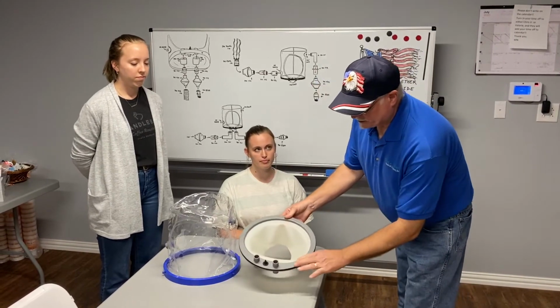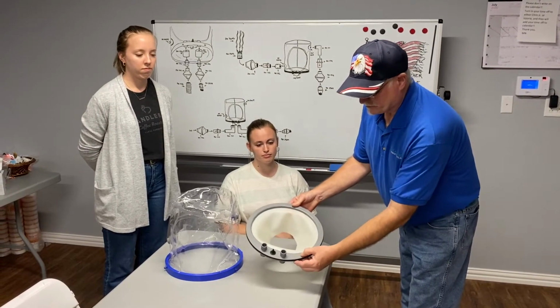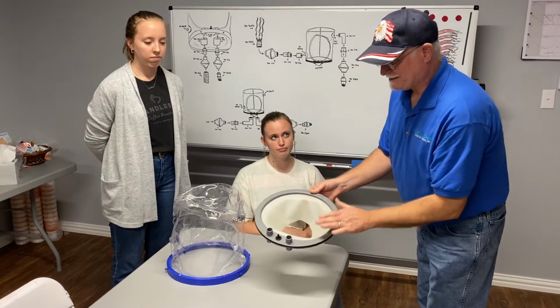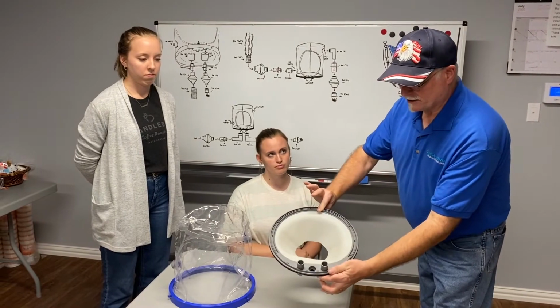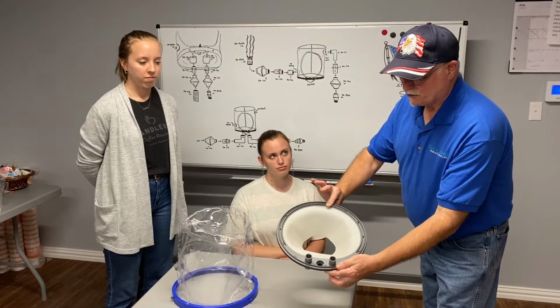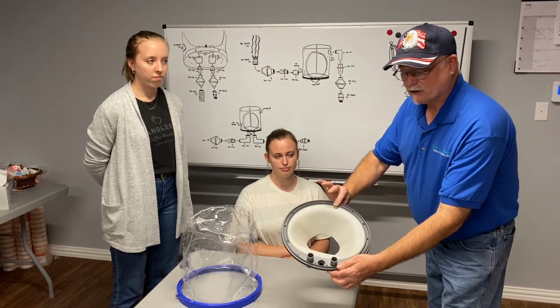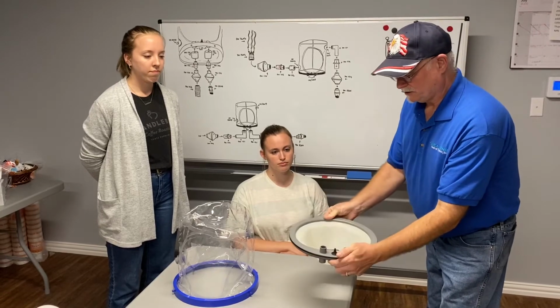You'll see a non-smooth surface with kind of a rough texture. You'll see the accessory port sticking out. This is the top, and it's always the top. You never install it like this. It creates a lot of problems. It won't operate correctly. It can actually be detrimental to the patient. Don't do this. Do it like this.